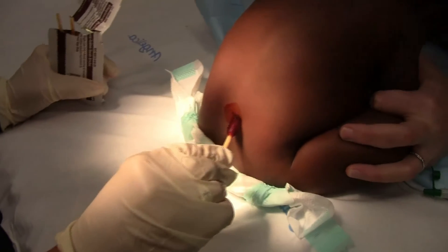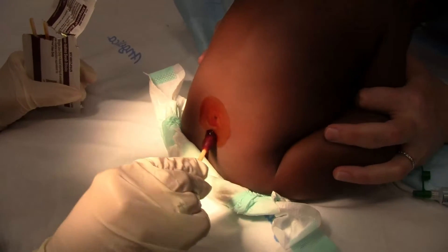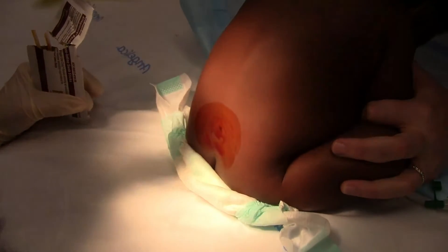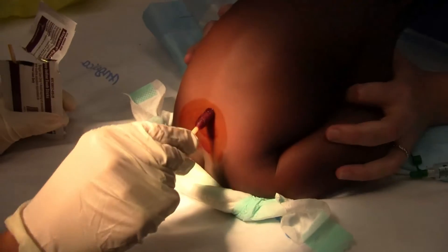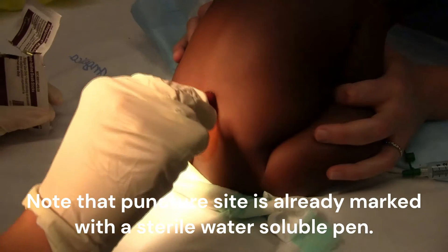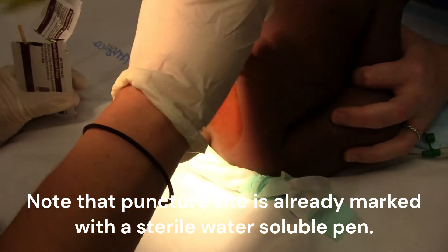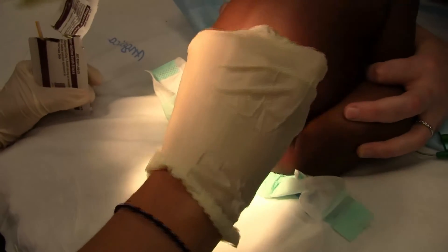After positioning the infant, clean the lumbar area with an antiseptic solution thoroughly. Two widely used antiseptics in clinical practice are chlorhexidine in alcohol solution and iodine-based solutions, such as povidone iodine. Start from the planned puncture site and apply antiseptic solution in an expanding circular motion using sterile gauze or a dedicated antiseptic applicator. This method allows cleanest to dirtiest progression, pushing potential pathogens outward.